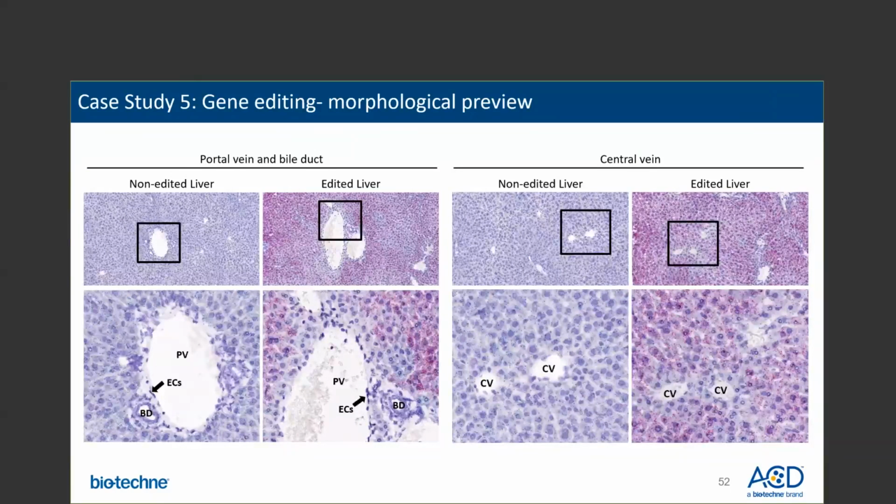Taken together, these results reveal the CRISPR-Cas9-mediated deletion was restricted just to hepatocytes. This methodology can be applied to various different gene editing and detection studies and help visualize the biodistribution of edited versus non-edited cells.